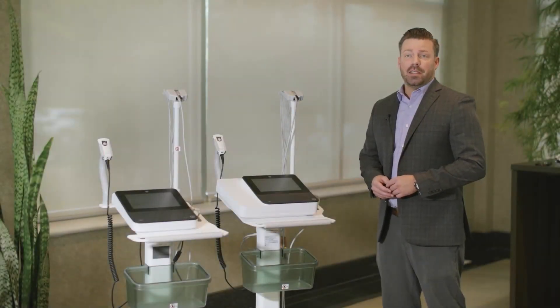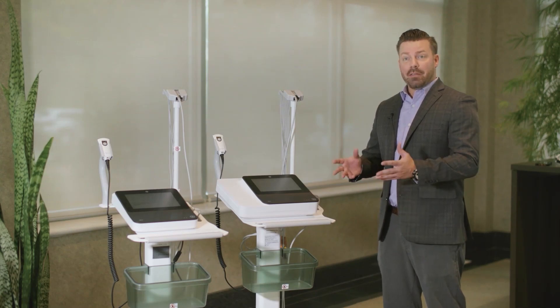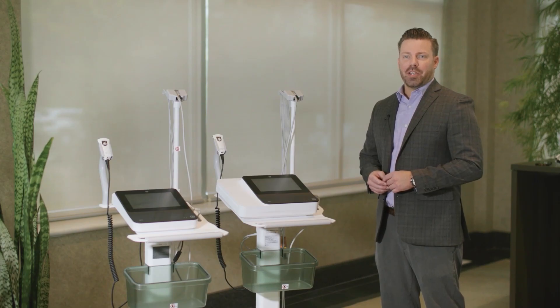We're excited to introduce the latest addition to GE HealthCare's MAC family of touchscreen ECGs, the MAC-5. The new MAC-5 is simple, precise, and secure.